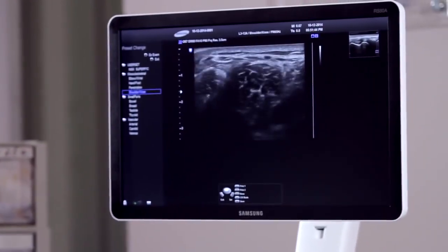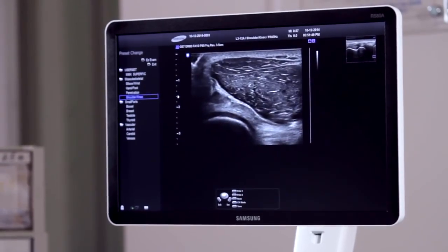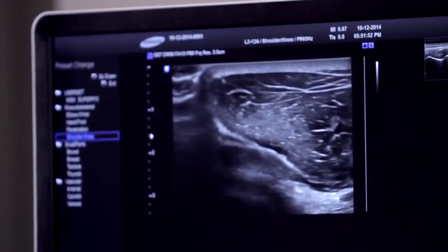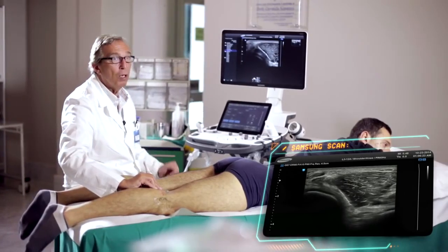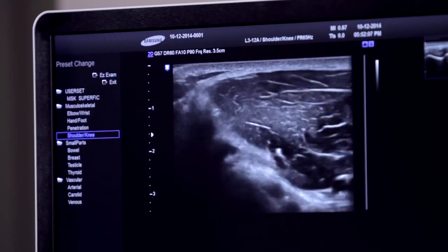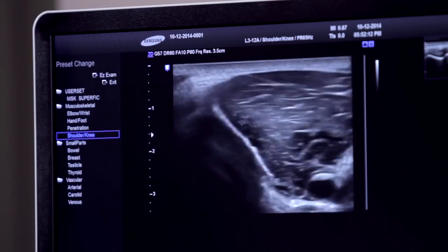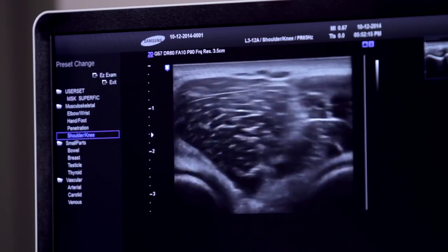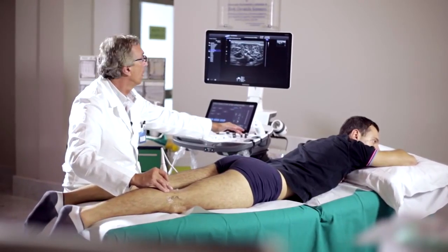Specifically, in this medial posterior region, we recognize the components of the gastrocnemius muscle and the semimembranosus muscle, which are contiguous and, as we know, are separated by the common bursa of the gastrocnemius semimembranosus. This bursa, obviously, in this case, is not visible as it is collapsed and not filled with liquid. Very often, however, it is highlighted in the form of an anechogenic bursa if, for example, there is a joint effusion. And another structure we encounter moving the probe towards the center is represented by the vascular nervous bundle.